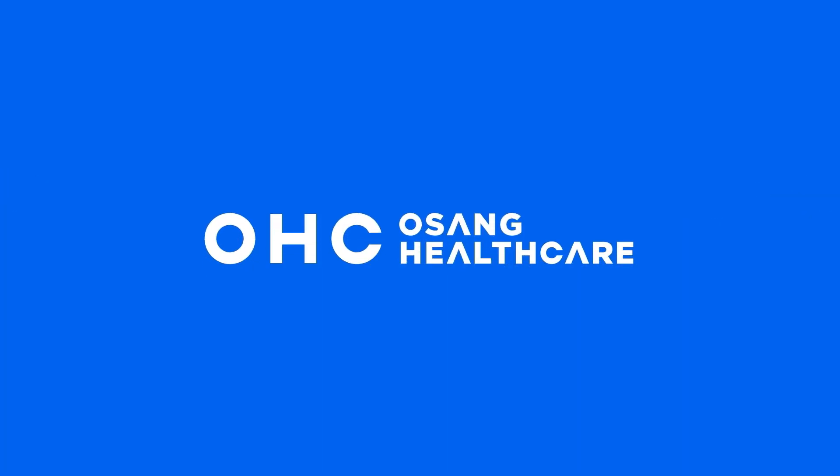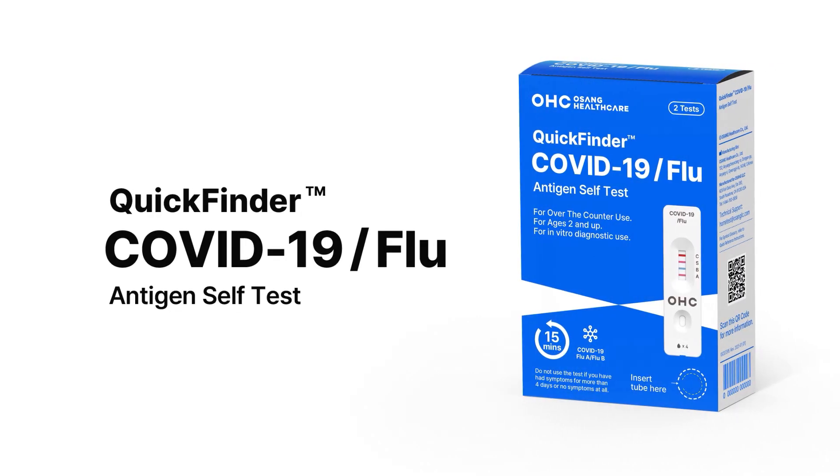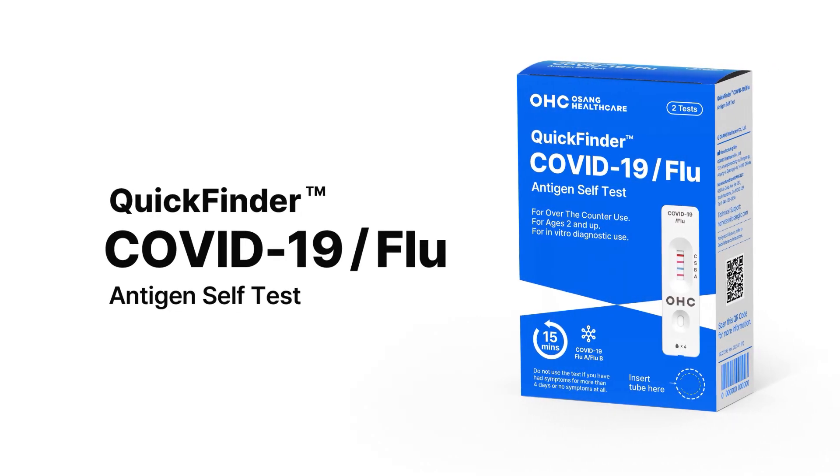Note: all on-screen information is presented through audio content. OHC Osang Healthcare. Today, we are excited to introduce our latest product, Quick Finder COVID-19 and Flu Antigen Self-Test.